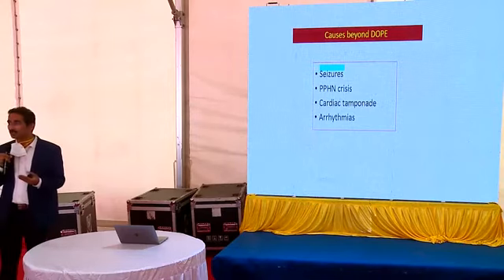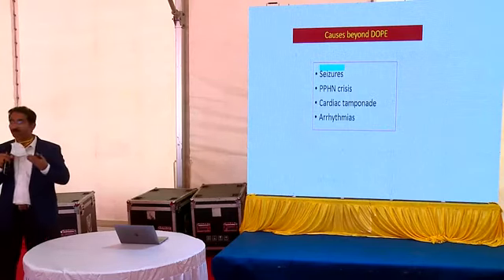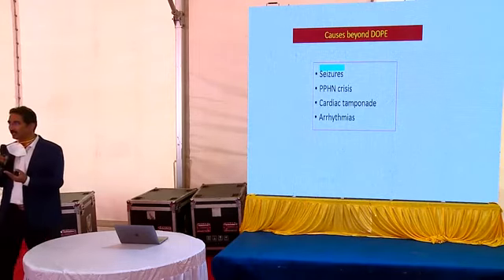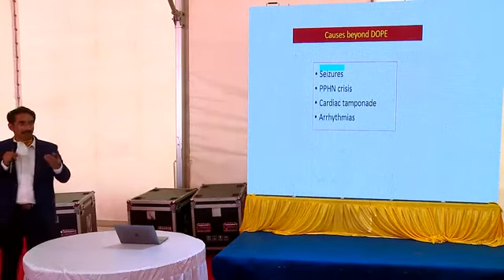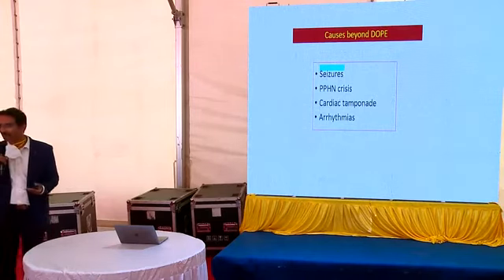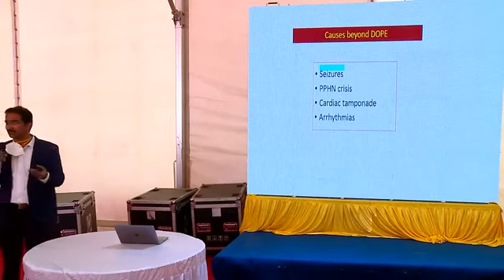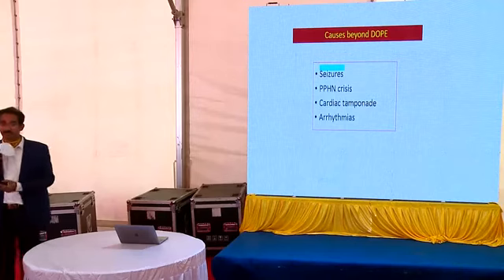Sometimes worsening can be because of pulmonary hypertension. So they behave the same way because not enough blood is reaching the lungs. You are ventilating the lungs well, fine. Your pressures and tidal volumes are reached, but the baby continues to desaturate, ends up having bradycardia because the blood is not reaching the lungs, and no matter how good the ventilation is, ultimately the systems are not getting gas exchange. Okay, so here, after ruling out DOPE, after looking at the pulmonary graphics, make sure the ventilation is good, and the next thing probably you should consider should be PPHN crisis.